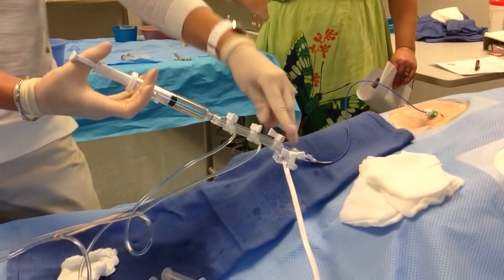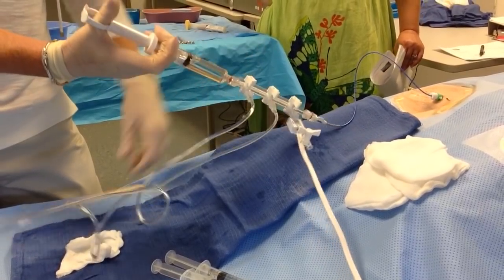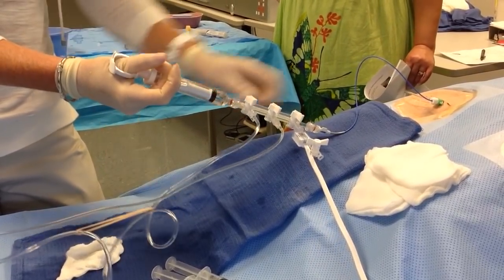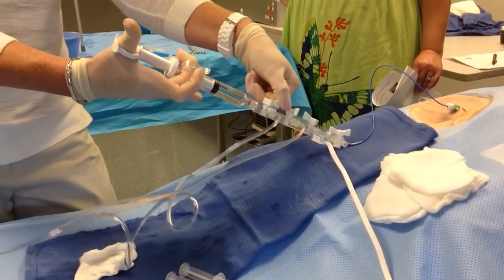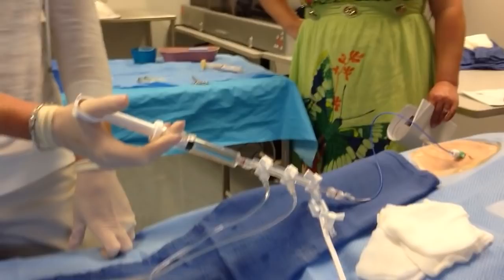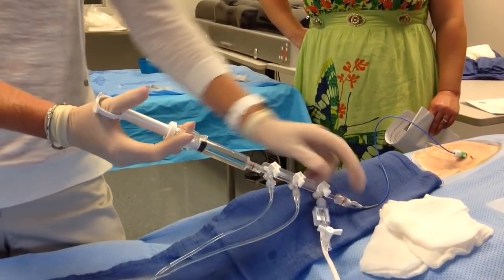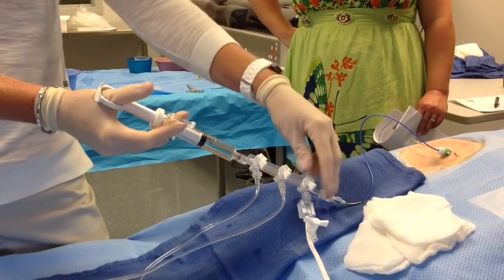So we look at the monitor. It looks good. Pull back, flush that through. Back on pressure, I get my contrast. And then we're going to do a test injection. We don't need to record AO pressure because we already got it. Okay? So test. It looks good.